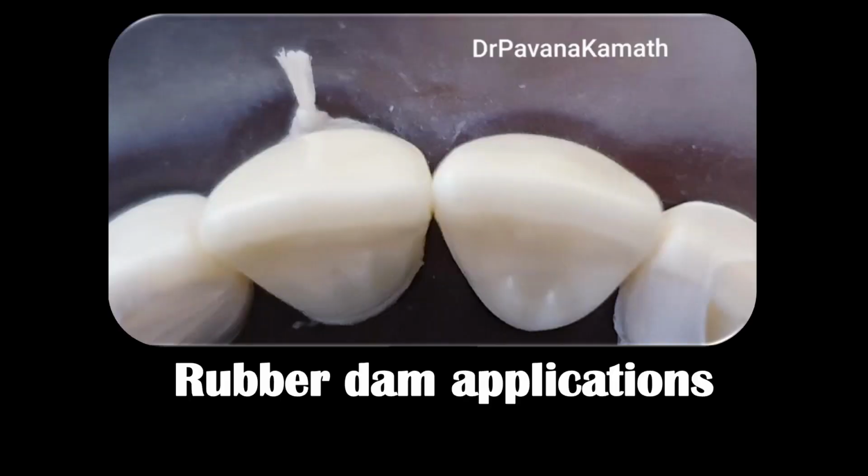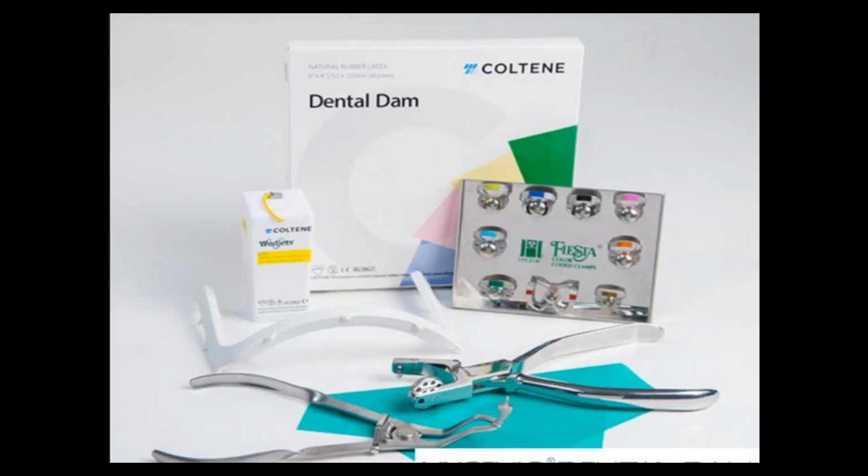Rubber dam applications, the topic for today. From the day it was introduced on 15th March 1864 by Sir Sanford Christie Barnum, it has become an invaluable, indispensable tool, and today, in the current COVID era, an important adjunct to control microbes, that is, in infection control during our procedures. And probably that is the reason why rubber dam is extremely popular and much in demand today, and we are here together again with a live demonstration and webinar.